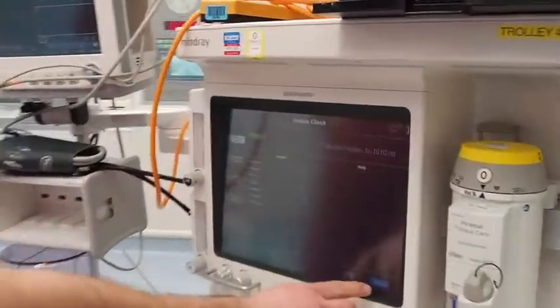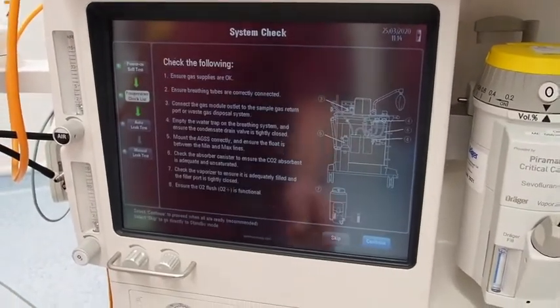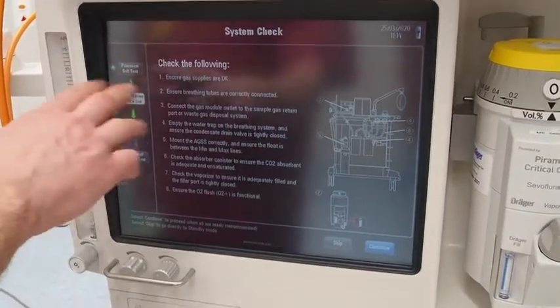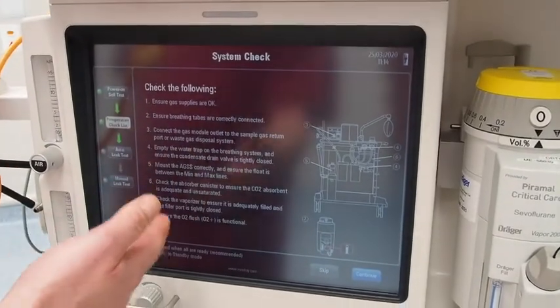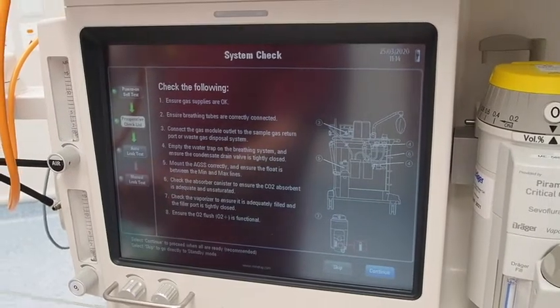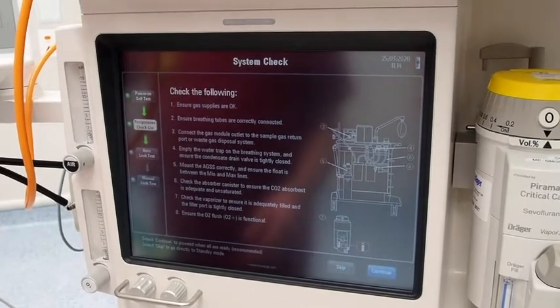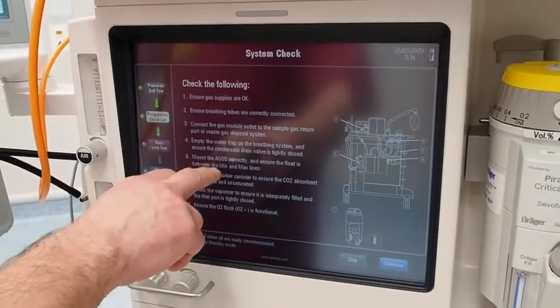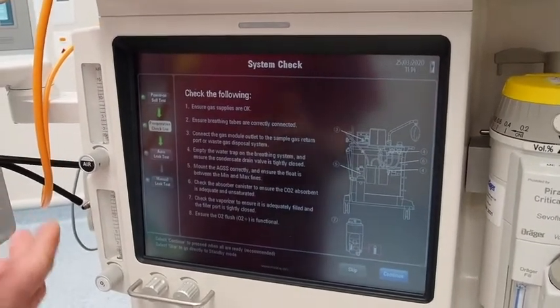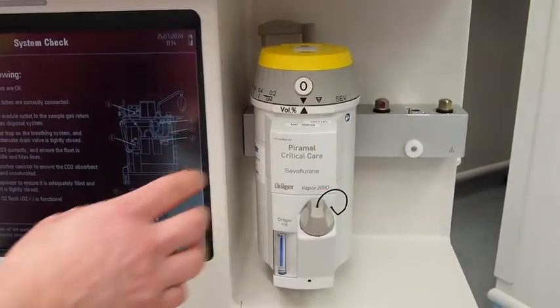This comes up on the system check screen, and you just press continue, and the machine will work its way through a self-check, and you just do everything that it tells you. So gas supply is alright, breathing tubes, gas module outlet, sample gas return is this tube here, and make sure that's attached. The water trap in the breathing system, this will be dry and I wouldn't worry about that. The AGSS is the scavenging, and there is a float to check the scavenging, but don't worry about that because we're not going to be using volatiles, and this is volatile anaesthetic agent, and we'll probably take these off the machines.